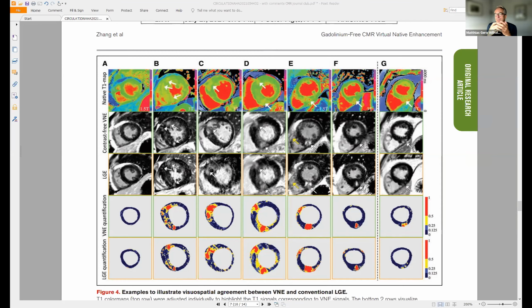But over time, do you think these engines, these algorithms, could be generalizable enough so that we can throw in a patient with, let's say, sarcoid, and we would still get the machine to figure out the areas? And what is your impression? You said you did not personally see that, but do you see the risk at all that we get some generated false information from that?